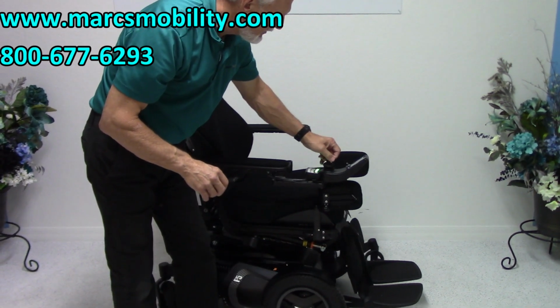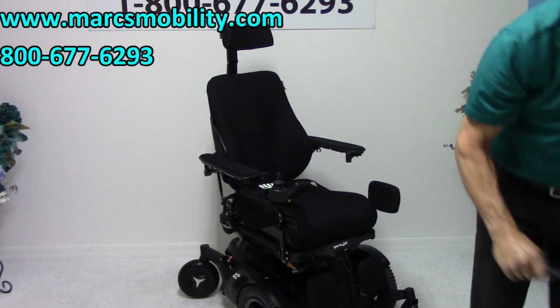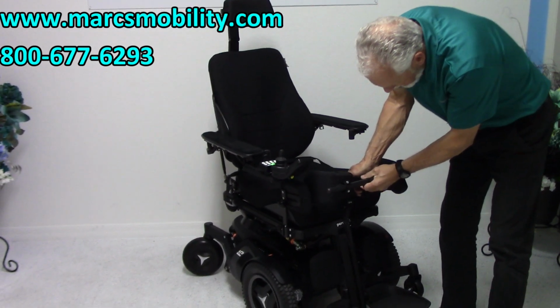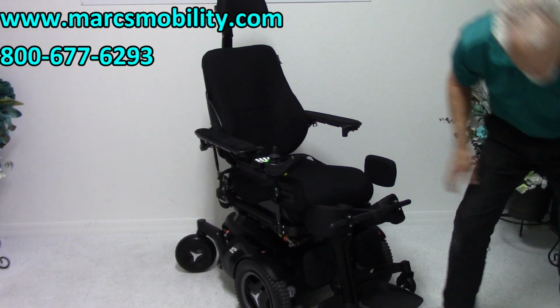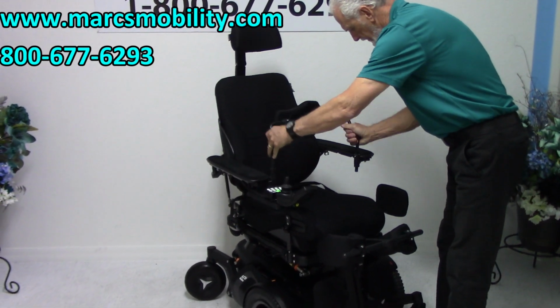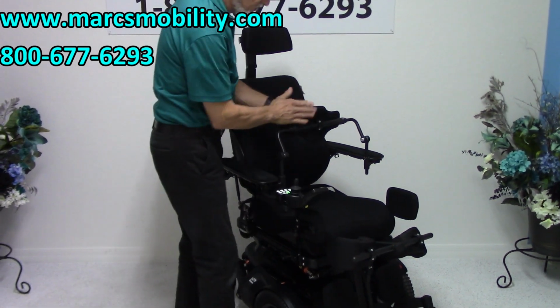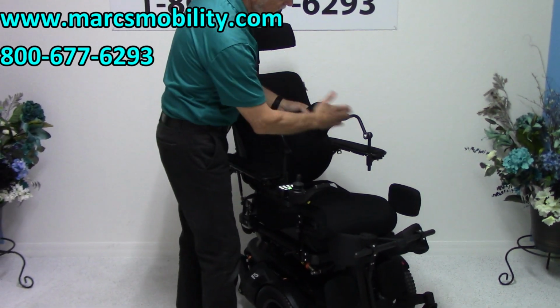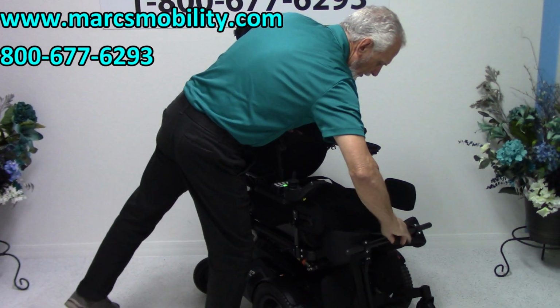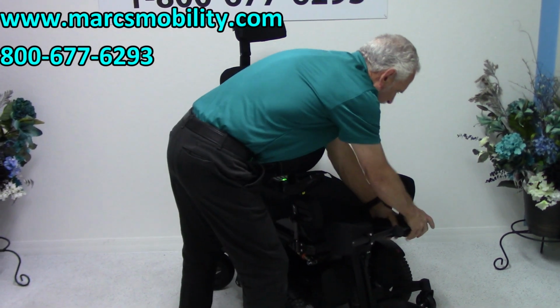So when you do the standing position, make sure that you put your knee brace on first. Your knee brace goes right in here like this. This will support your knees. And you always have to have your chest guard. So if you're sitting in the chair, this chest guard is all adjustable. You can adjust how far forward you want it. Same thing with the knee brace. There's an adjustment here for your knee brace. And these move up and down just like that.